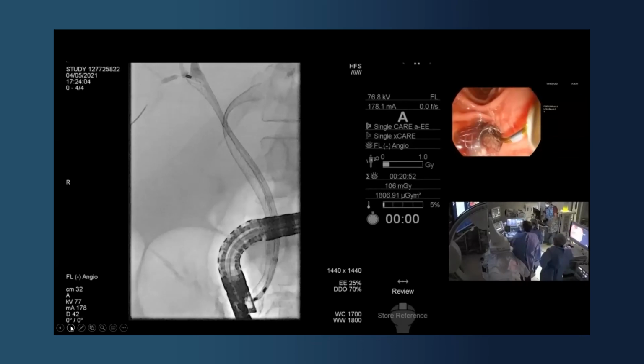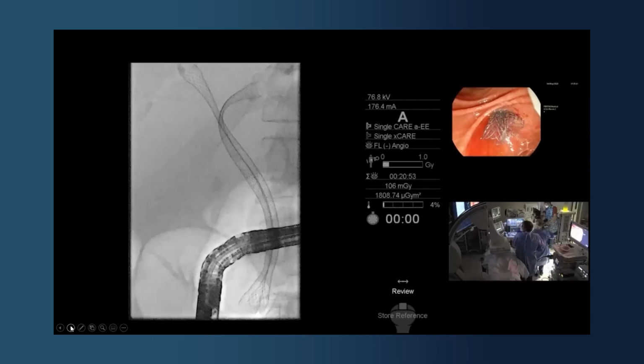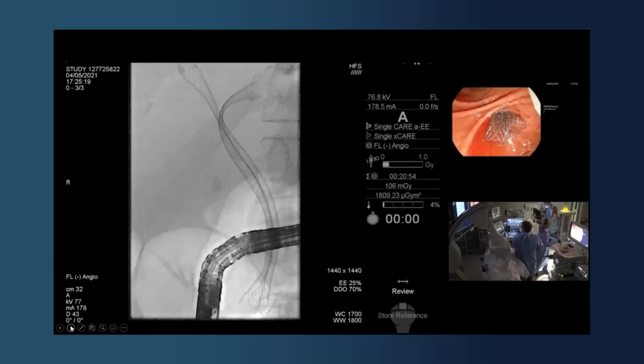Good. So that's what we like to call the shotgun appearance at the end. Not only aesthetically pleasing, but really important in the event of needing further ERCPs, because now we've got access. And take that, please, and both sides draining really nicely. Okay, thank you very much.